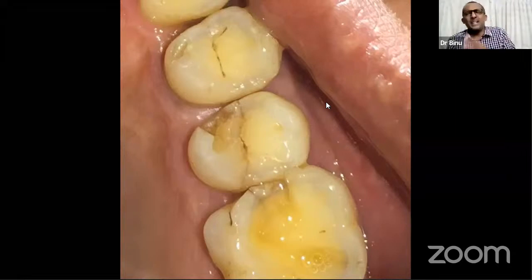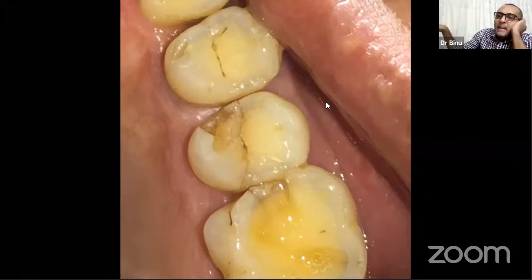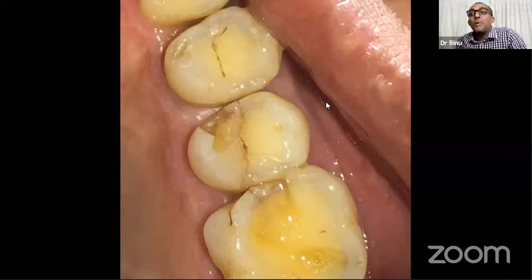Invest in an intraoral camera, 3,000, 5,000 rupees. At the next conference or wherever you go, buy it, just buy it. It is worth it, let me tell you. In every case, before even looking with mouth mirror and probe, many times I just do this and tell the patient to come. Let's see here. Big screen there. Let's see what all is happening. Because you already saw it, you know what is happening. The best part about that is they might be better convinced about other teeth also.